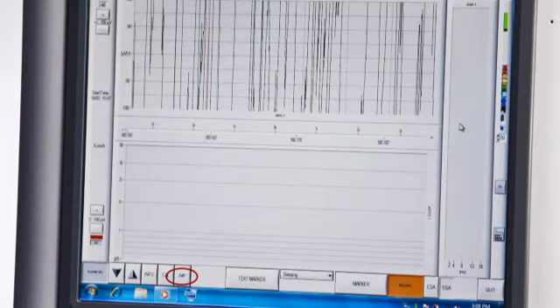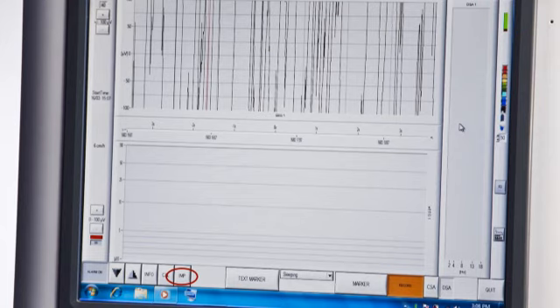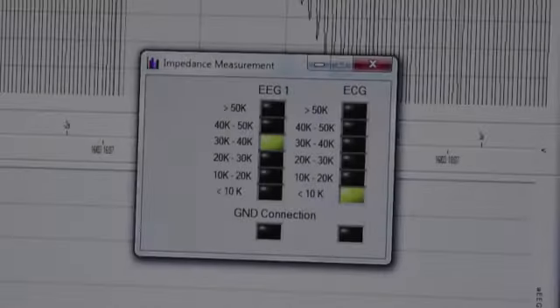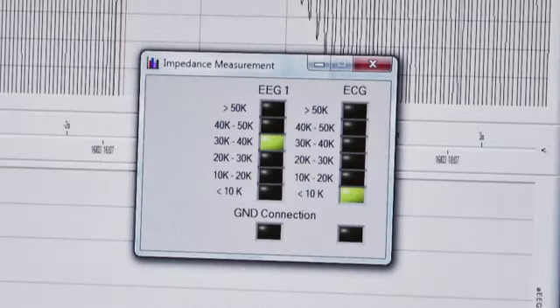To run the impedance check, click on the IMP button. Impedance is a direct measure of the connectivity between the patient and the monitor via the electrodes. Low impedance means there is good contact. High impedance means there is poor contact.